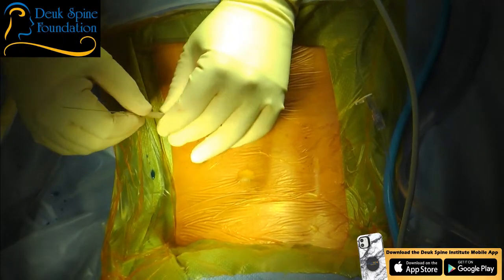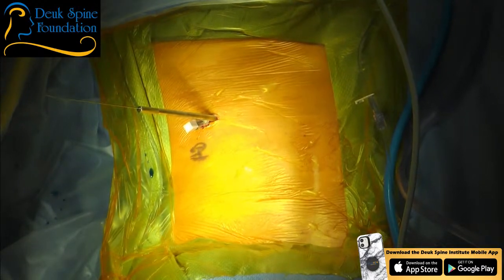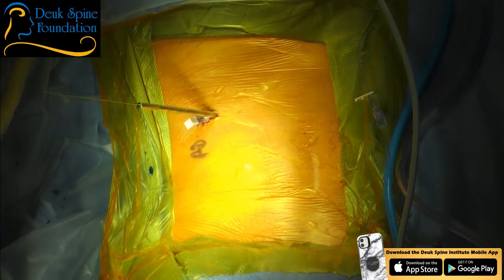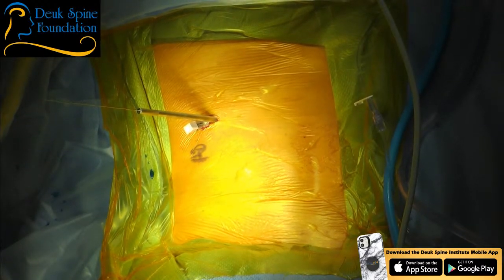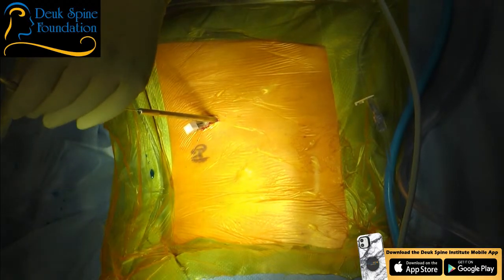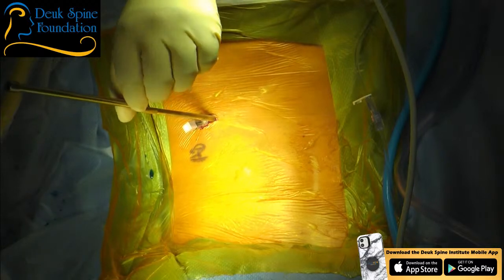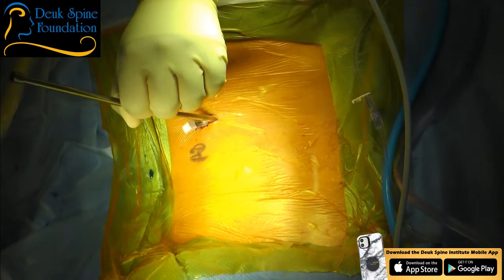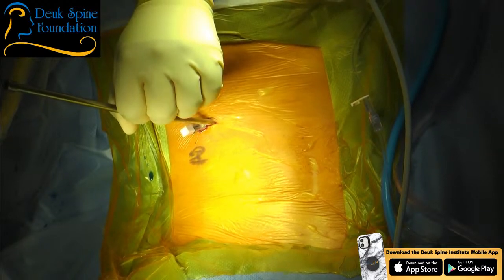All right, the tip of the dilator is now sitting at L4-5, and it's right at the herniation. So I'm not going to enter the herniation and the tear until my anesthesiologist tells me the patient's ready, because otherwise it's going to be very stimulating for the patient. So it's best to wait until she's sleepy. Let me know whenever you're ready.